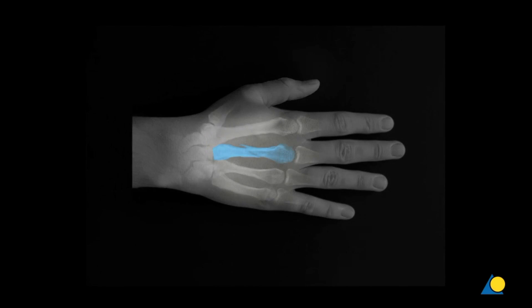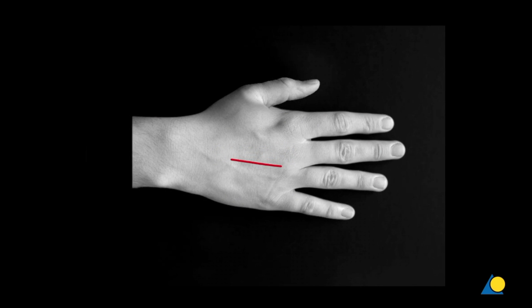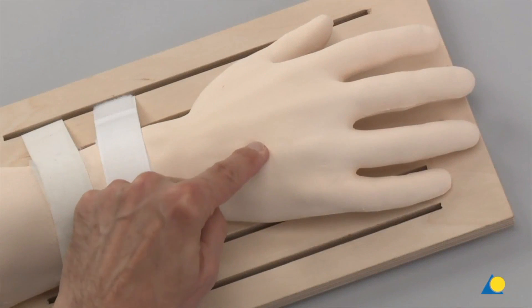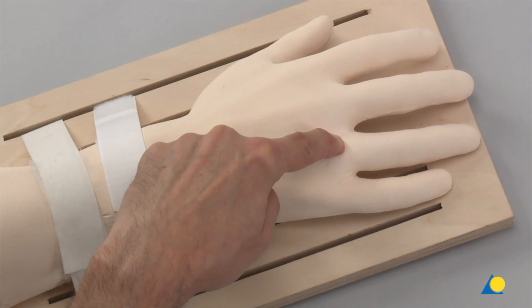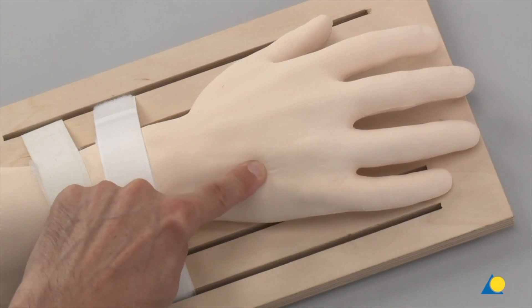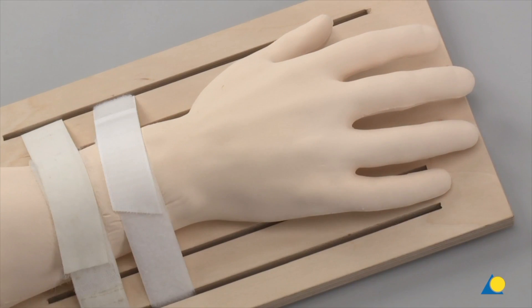The approach to the third and fourth metacarpals is made through a dorsal longitudinal skin incision between these two bones. The fourth metacarpal is palpated, as is the interval between the fractured and the neighbouring metacarpal. Depending on the fracture pattern or any soft tissue lesions, the approach is made between the third and fourth, or fourth and fifth metacarpal. To reduce the risk of peritendinous adhesion, incisions directly over the course of the extensor tendons should be avoided. In this exercise, the approach is made between the fourth and the fifth metacarpals.